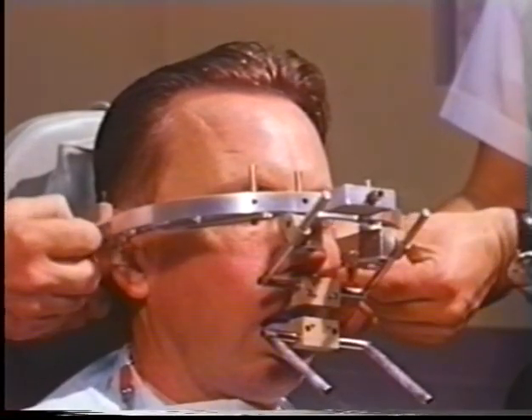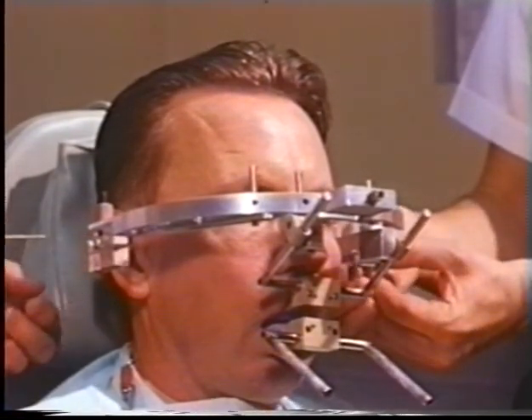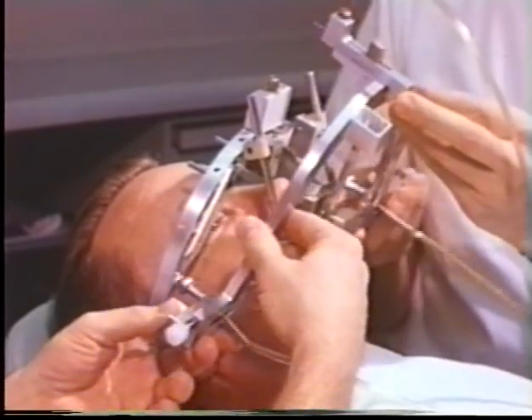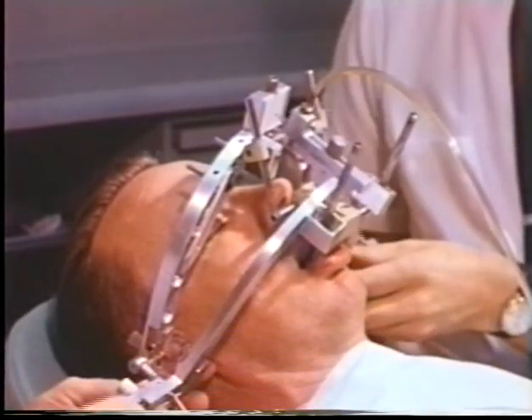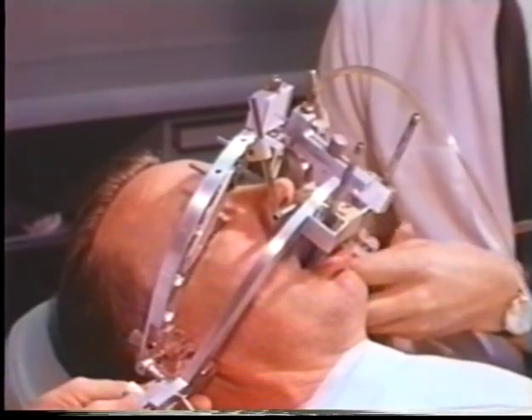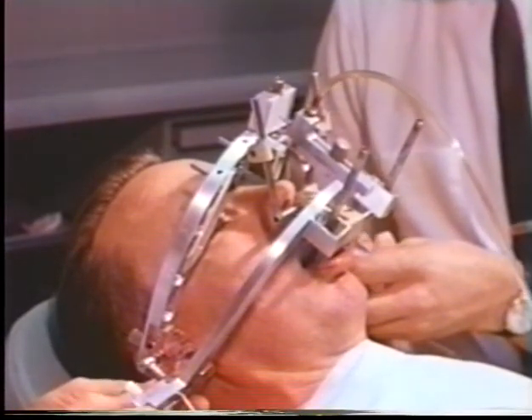The two alignment pins are removed from the alignment blocks, and the subject is placed in a supine position. The mandibular bow is lowered over the attachment frame so that the ends of the frame protrude freely through the attachment tubes. The lateral recording drills, which have a common axis, are inserted into the holes previously occupied by the alignment pins of the upper bow.